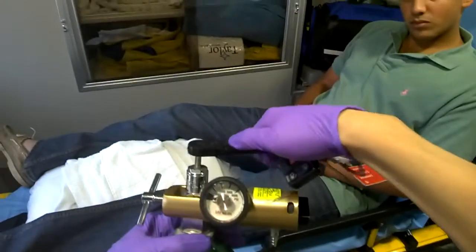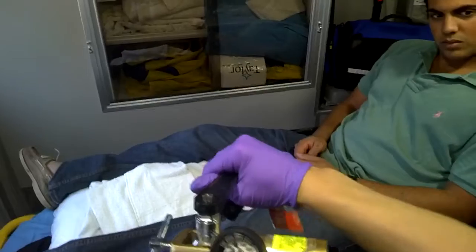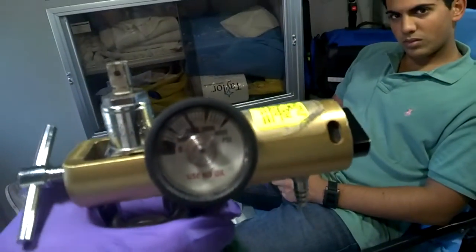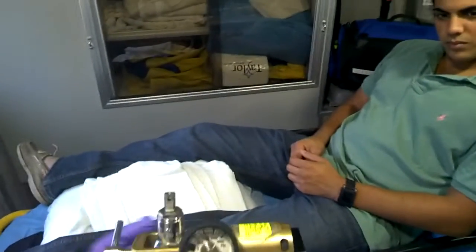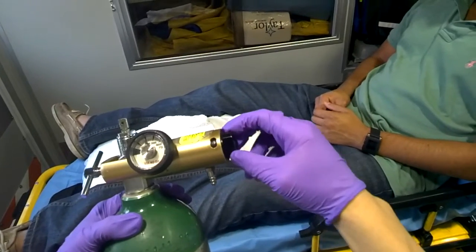And once you do that, you want to open up the oxygen tank. So righty tighty, lefty loosey. And right now this oxygen tank is at 2000 psi. And the bare minimum is 1000. Once you hit 1000, you want to replace it. So this is how you control how much oxygen comes out. And if you want to hold on to that, Alec.